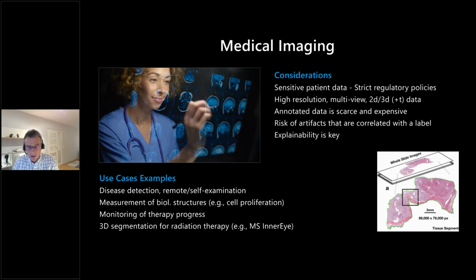And in particular, when it comes to medical data, it's fair to say that annotated data is scarce and quite expensive. So for example, if you consider a stack of images and you have a segmentation case, it can take hours, sometimes even days, until you have annotated data. And the quality of the data, the annotations, is quite different. So there are cases where we use NLP techniques to automatically generate those labels from medical reports.